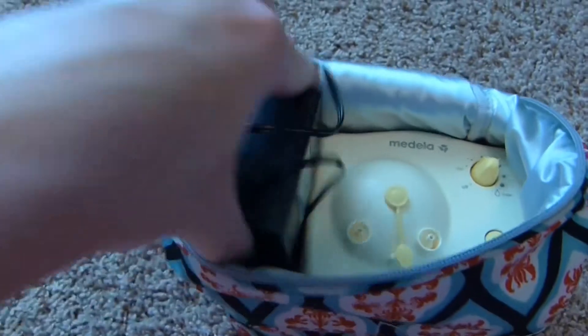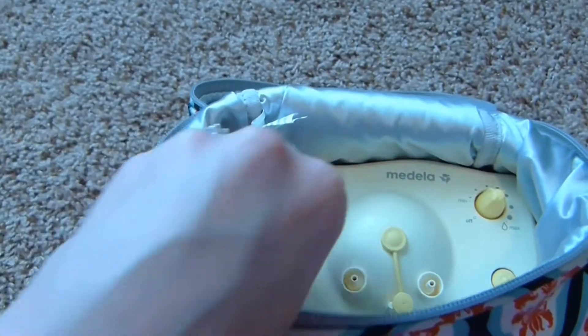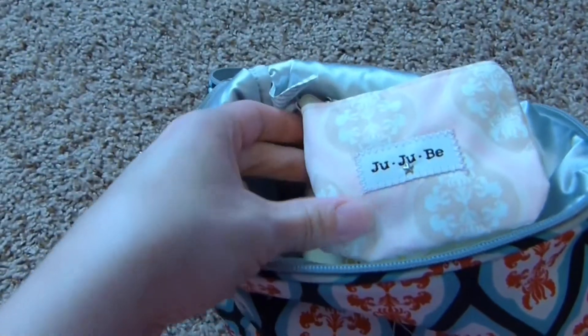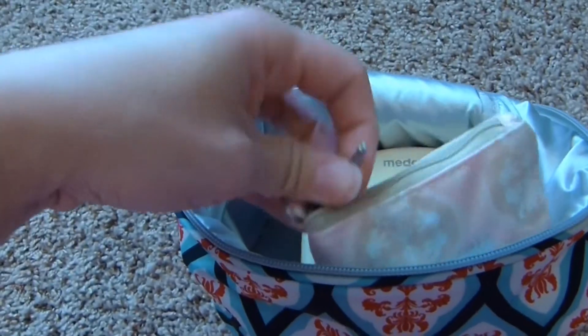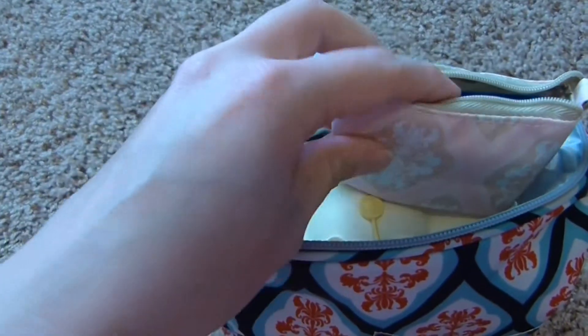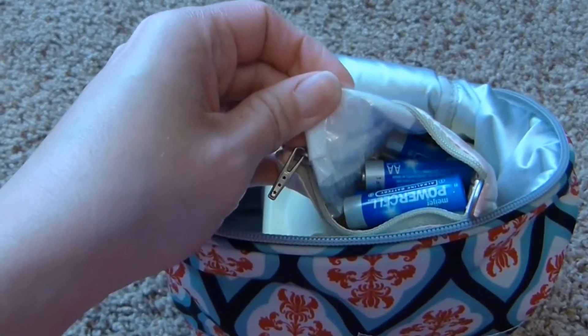The battery pack fits nicely right next to it. And then in this little coin purse in the blush frosting print, I keep my extra batteries. I don't want to run out of battery power — like I said, I like to be super prepared.